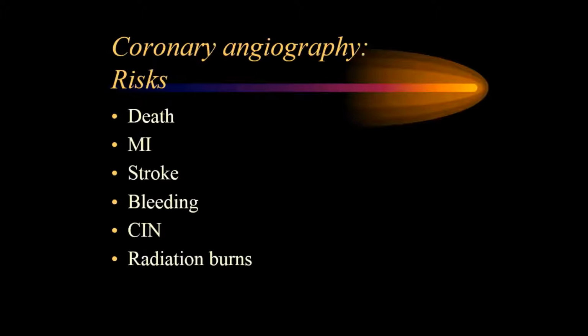But there are other smaller risks, but these are the most important serious risks that you need to quote when you are consenting a patient, because patients, before they undergo coronary angiography, need to sign an informed consent. So before any invasive procedure, and coronary angiography is an invasive procedure, patients need to be aware that these risks exist, because they might decide to change their mind. After all, it's them who are having the angiogram, not us.